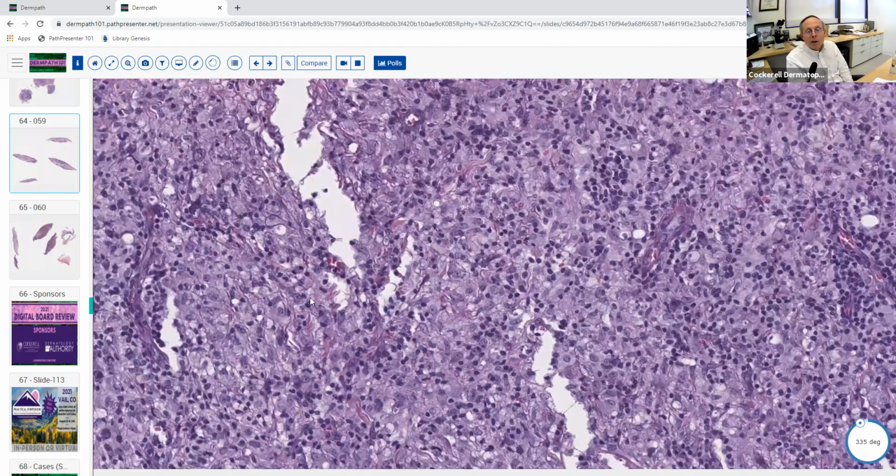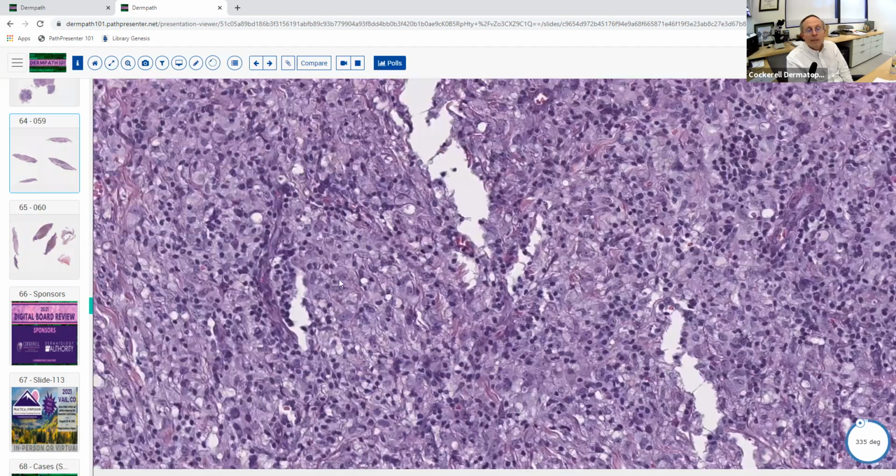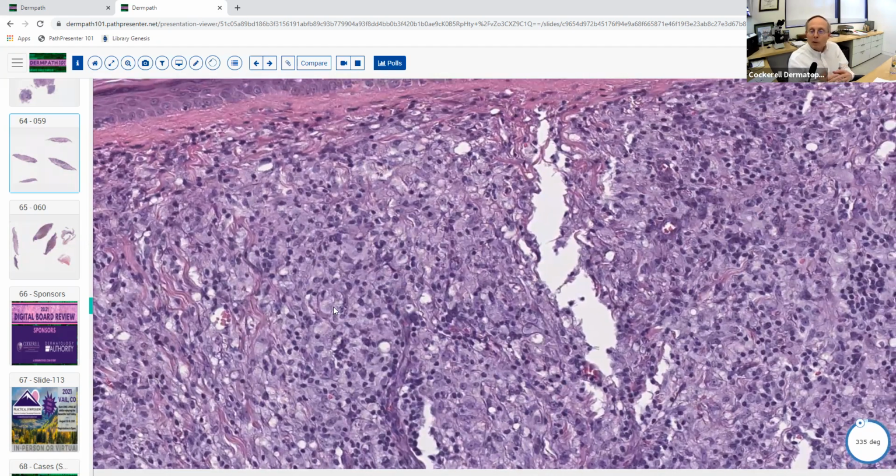So again, we saw a histo; here we're seeing a different type of organism. These cells have foamy material and look like little globi within the cytoplasm, like you see here, globi, like a handful of cigars. The classic diagnosis there is going to be Hansen's disease. So hopefully you would recognize that.